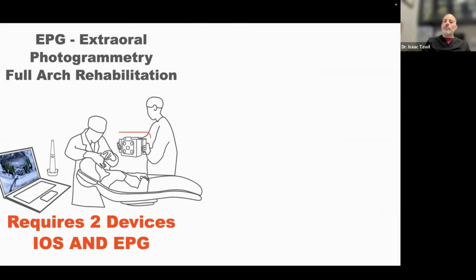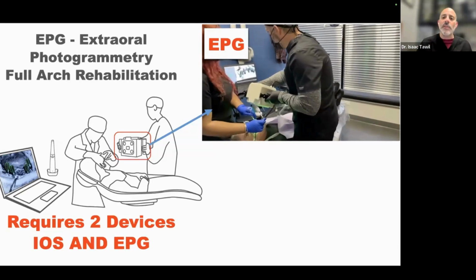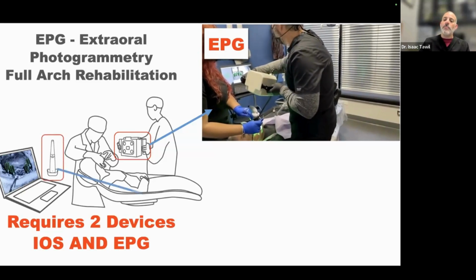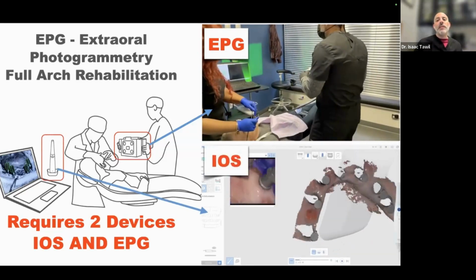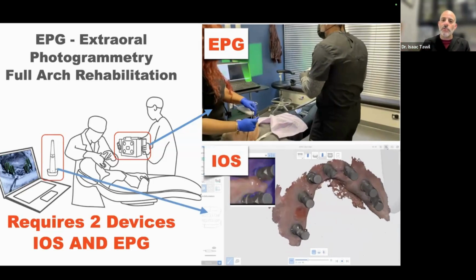So the extraoral photogrammetry will only capture, you'll see I'm holding this device outside the mouth, you'll see these green flags in the background. It's blocking everything else out in the background. And while the intraoral scanner will capture the soft tissue, we may want to use some scan bodies or healing caps to give us some form of alignment. And then we'll have to do a matching in a separate, third-party software, to match those pieces together to be able to go ahead and design a case.